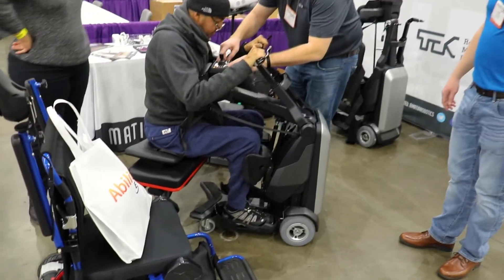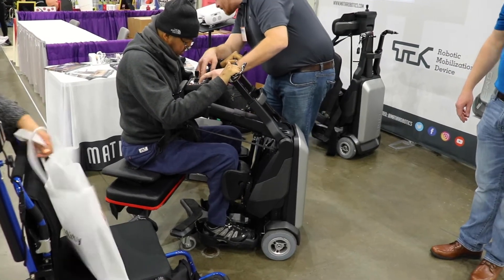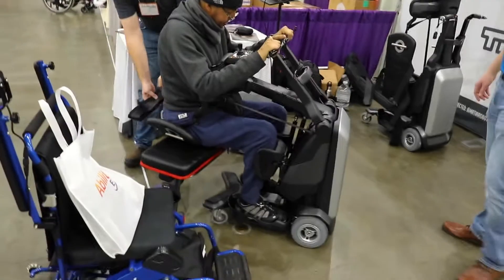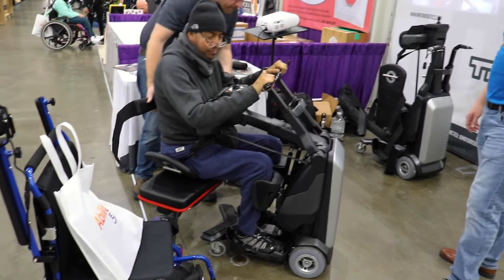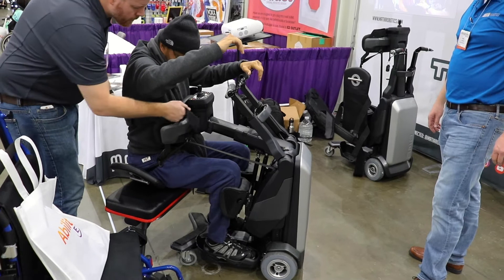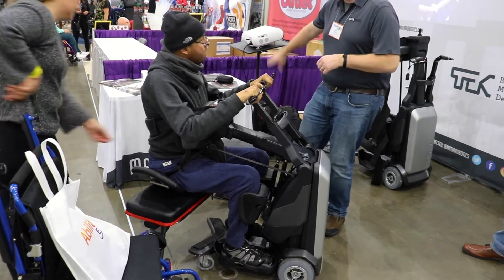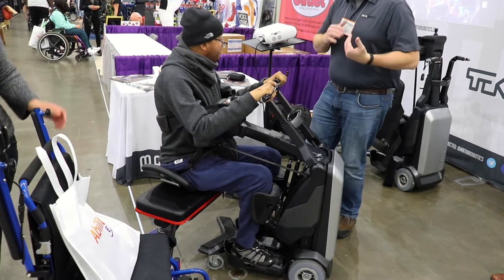We've got this set up here — this enables the belt mode. So when it's on there and enabled, blue is the belt mode. You should draw it in. And then I'm going to put the extra support strap on it. This right here, you can lift it up. And that's just Velcro, so that part's adjustable as you stand up. For this, some folks like it if they need the trunk support. Most folks just take it off — it's Velcro attached. Since you've never done this before, it'll be more fun getting you up into it with that on.